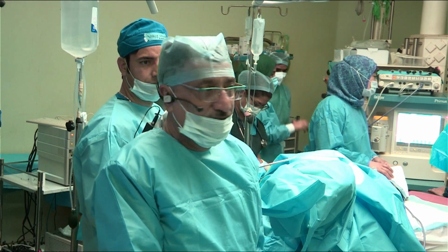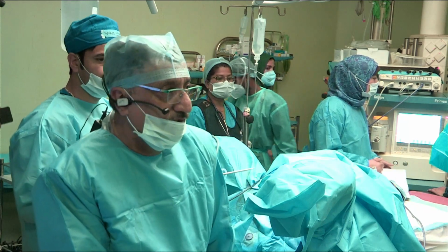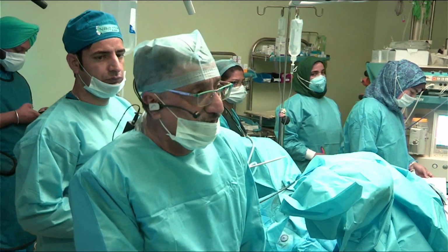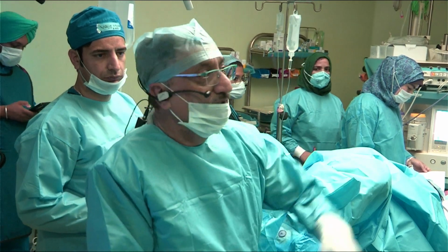Good morning, everybody. Hello? Yes, sir, you are audible. Okay, fine. So, we'll be starting with the first case. Yes, sir. And I will be demonstrating RIRS. And the case details will be shown to you. Okay, sir. Tell me.